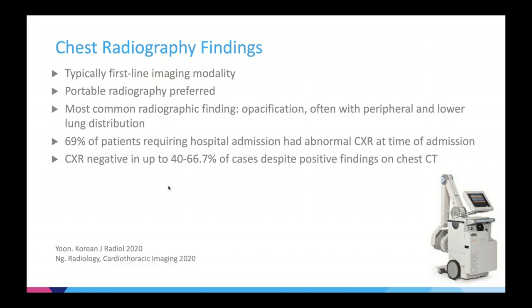For example, this is a 25-year-old female presenting to the ED at Mount Sinai with seven days of fever and shortness of breath, subsequently diagnosed with COVID-19 based on RT-PCR. The chest x-ray was completely negative and normal. However, on the chest CT done within a day, you can see multiple areas of round ground glass opacity at the periphery and posterior areas of the lung — typical for COVID-19 infection.